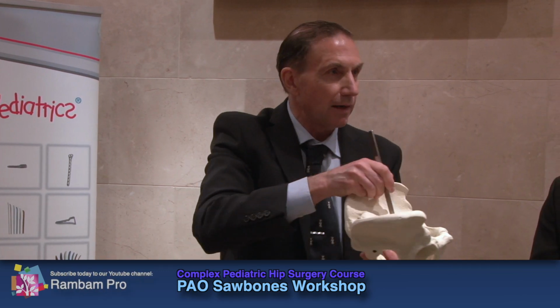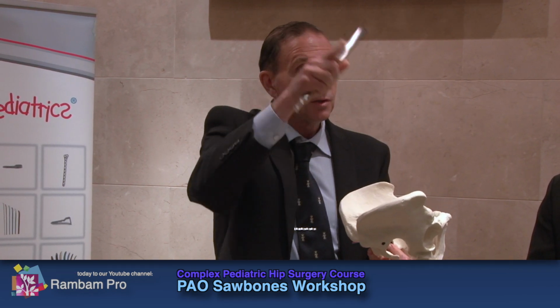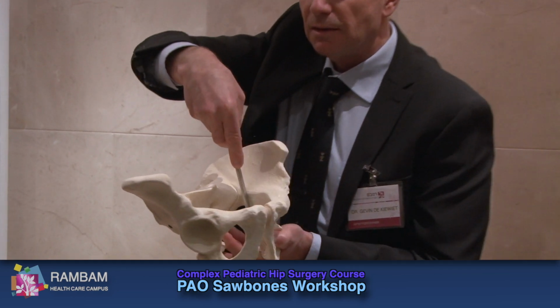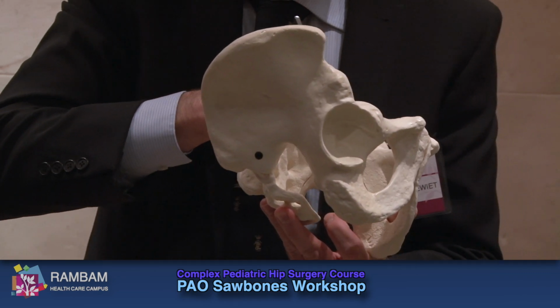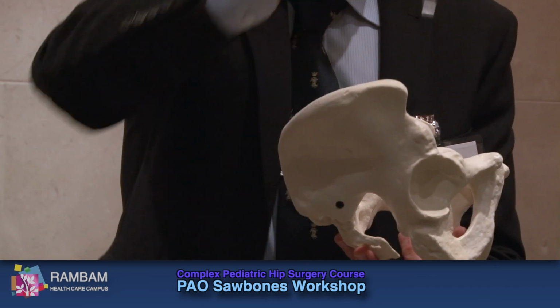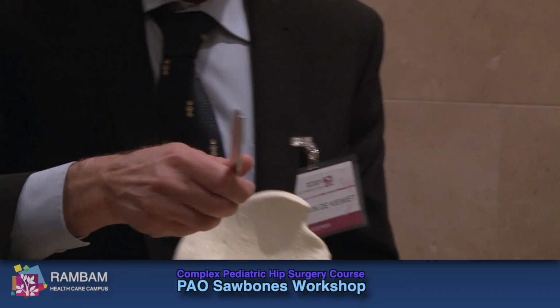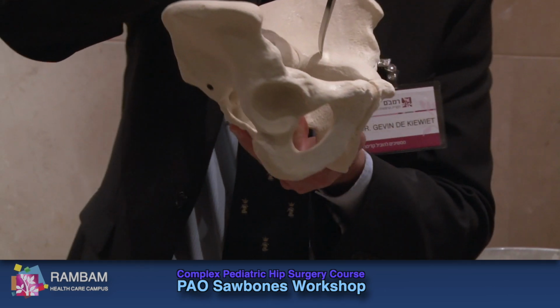Then take the image intensifier, and I'm going to rotate it in again, so we can see the ischial spine. You can see the ischial spine and the acetabulum. You want to be going directly between the two. You want to bisect the posterior wall going down towards the quadrilateral plate. I take the one osteotome and I just go just that cortex down towards where I think my other osteotomy ended, or as Scott was saying, where you've got the osteotome still in the osteotomy site, you go down towards that. The other sticking point he said was this angle here. So if I take an osteotome, I'll take this one, and I put it in that hole there.